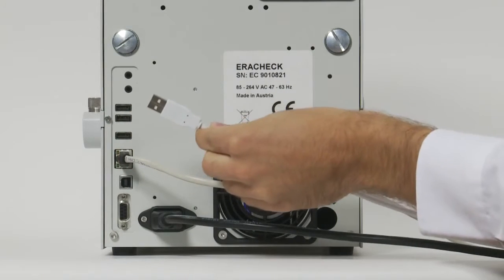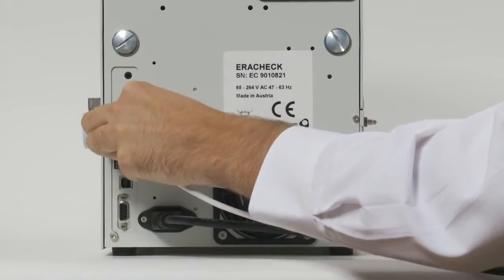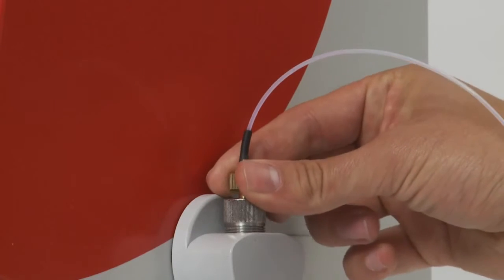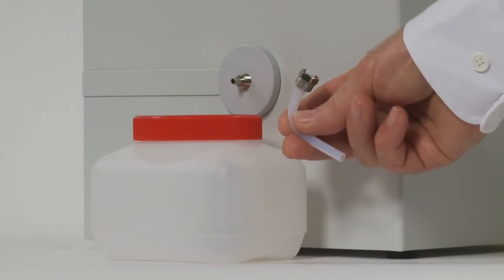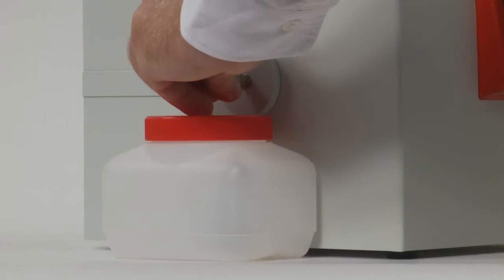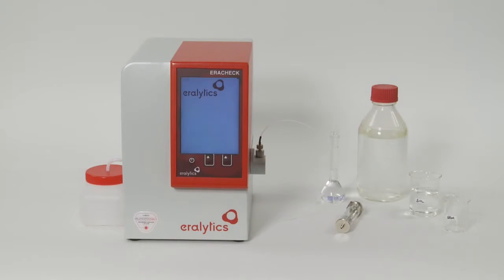For data transfer or remote control, the unit can be connected to a network by the Ethernet interface, or directly to a computer or printer using the USB ports. Put the inlet tube in the Luer inlets on the right side of the instrument, then place the waste container next to the instrument and connect the outlet tube to the outlet on the left side. Switch on the analyzer by pushing the power button on the front.